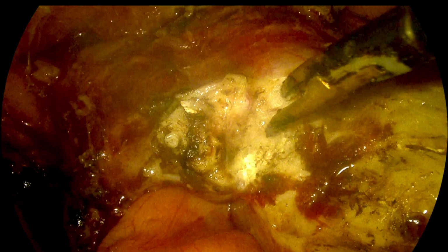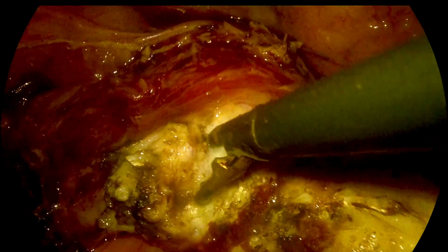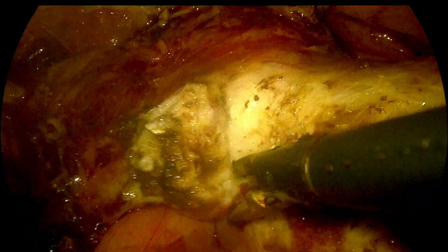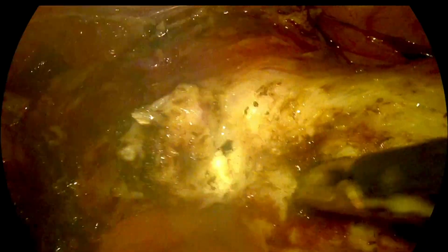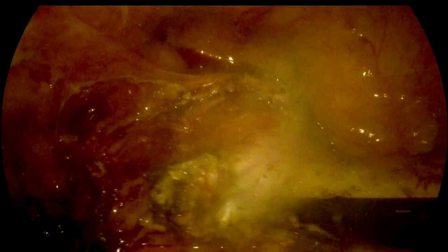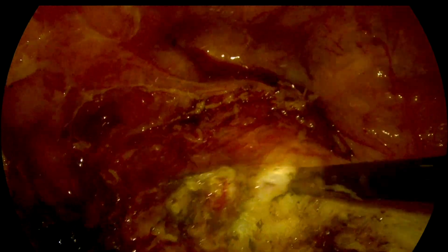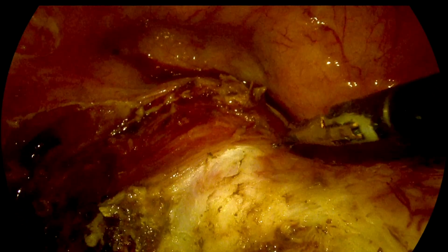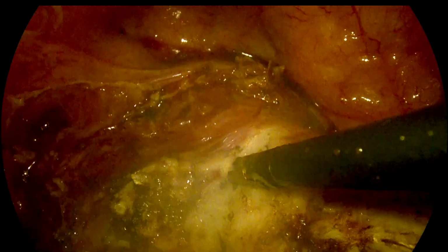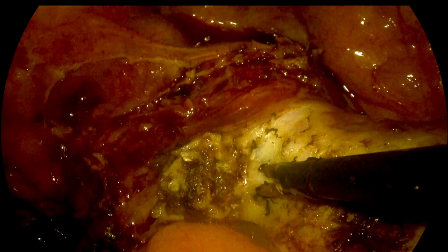We are almost completing the dissection on the left side, going well below the cervical area, and coming very close to the uterosacral ligament, which is the final dissection point on the left side. Once this is complete, we can continue the dissection on the right side, and a similar process will be done there also.